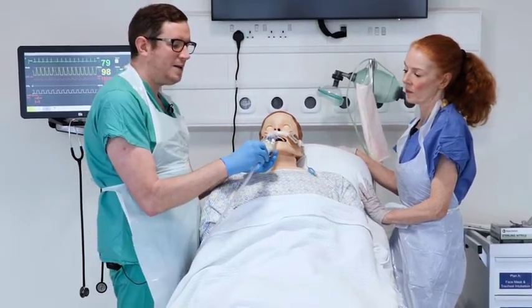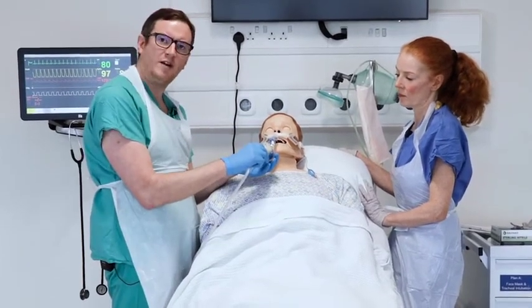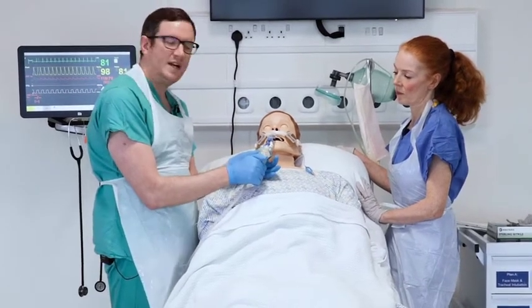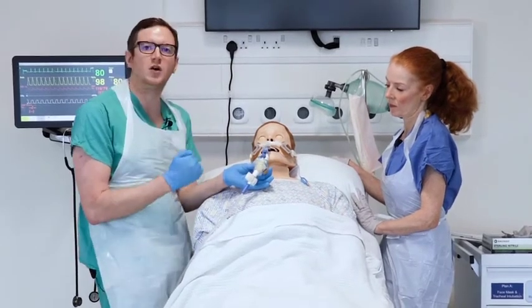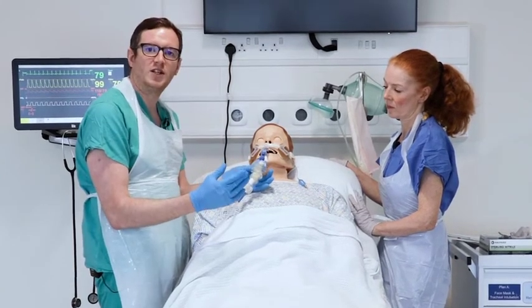If at any point you meet resistance, it may indicate a blockage higher up, or if you are quite far down, you may have reached the Carina. If you start suctioning at the Carina, it will cause damage. So pull back one to two centimetres before beginning suction.